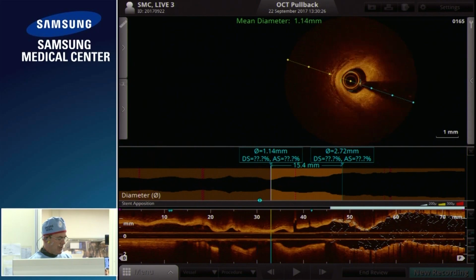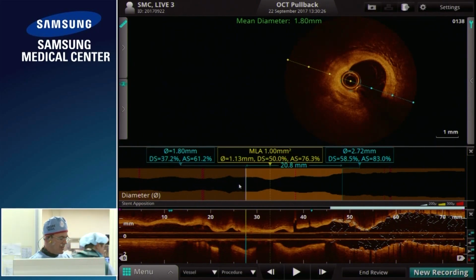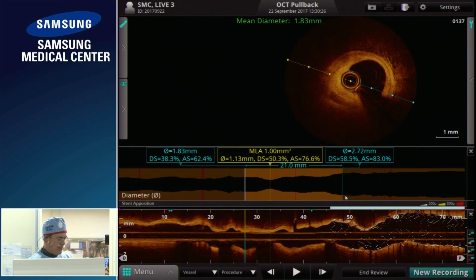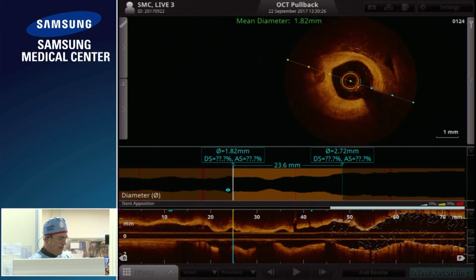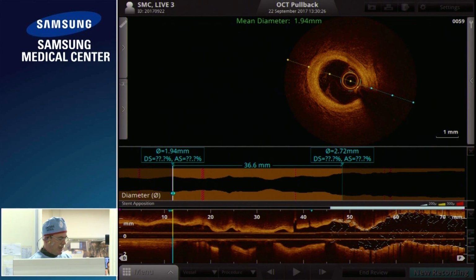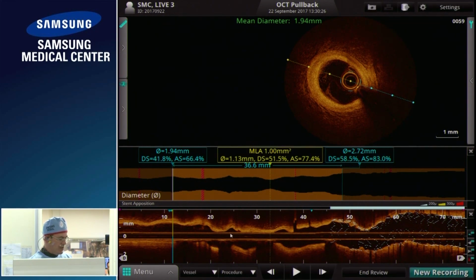We could put a 20 millimeter stent in, covering the distal stenosis, from this point here down to here, or we could go beyond the distal lesion into this segment and put in a 2.5 by 38, with 2.5 in this section, and post-dilate with a 2.75 or 3 in this section. That's certainly what I would do in my practice. The alternative would be to use a drug-eluting balloon in this segment, a 2 or 2.5 millimeter drug-eluting balloon. I'd be interested to hear what the panel thinks.